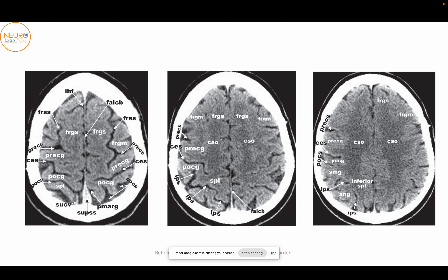It's important to note that bone is going to be a lot more obviously seen with CT, and the bone is going to lead to some artifacts — you can see there's a little bit of blurring around the bony edges. So that's also an important thing to realize: bone does lead to some artifacts in a CT. Now coming to the anatomy itself, let's discuss whatever we can see in the axial scans. We're going to start from superiorly and then go inferiorly.